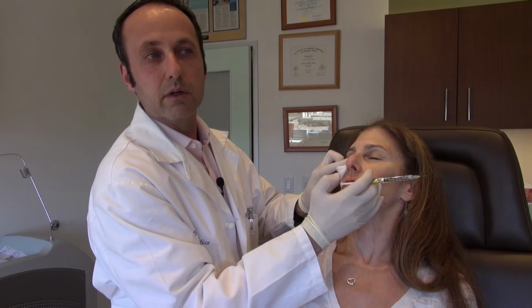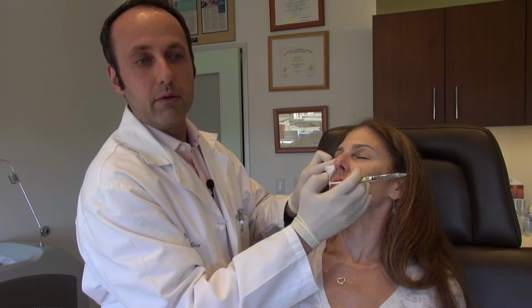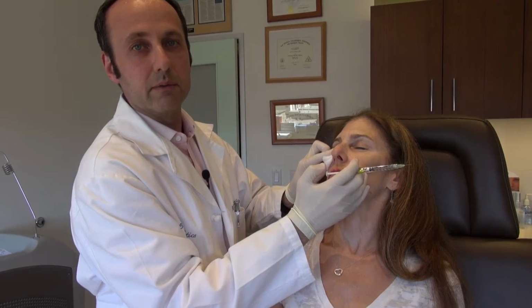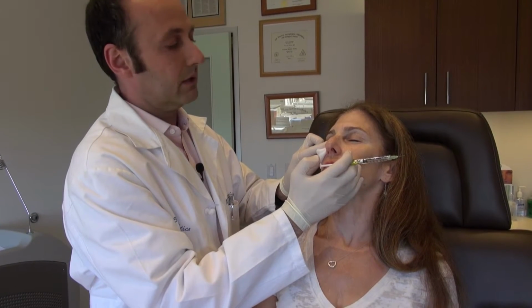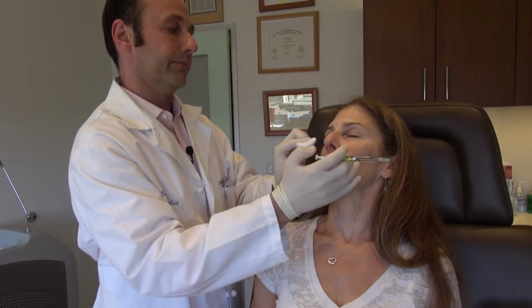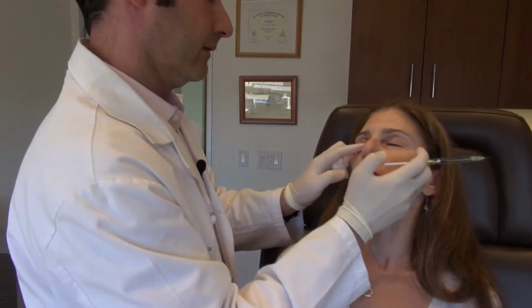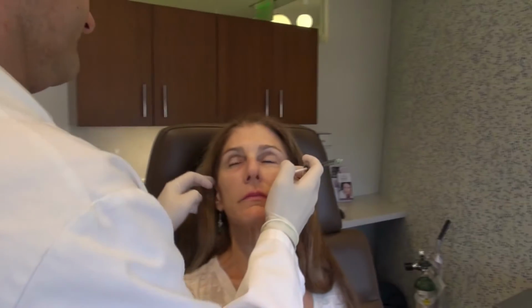In order for the filler to get into the retinal vasculature, or the ophthalmic vasculature, you have to put it in with enough pressure to overcome systolic blood pressure. And so if you are just injecting gently, you don't have that kind of danger. Okay, open your eyes.